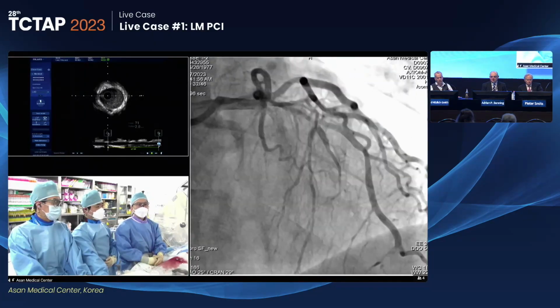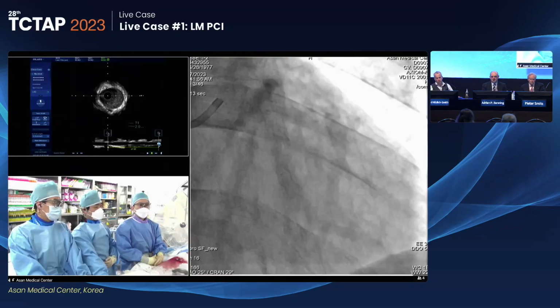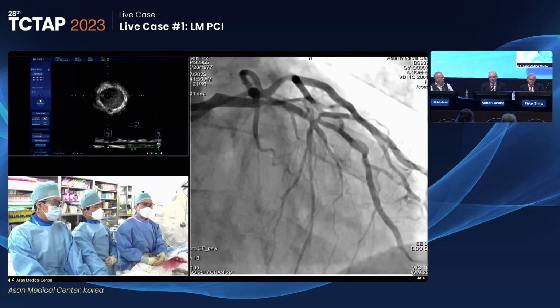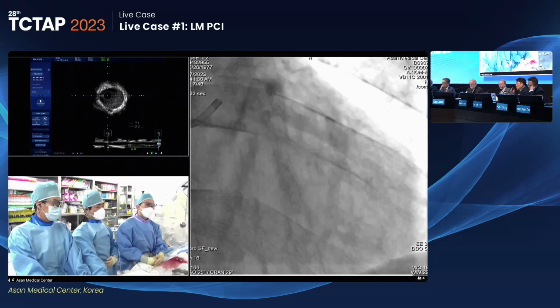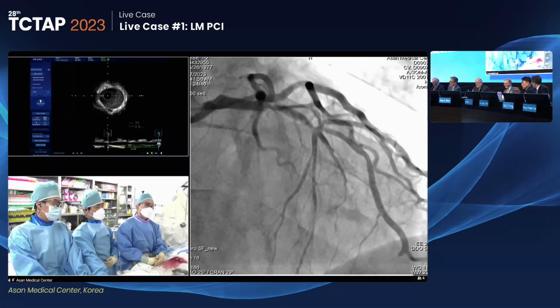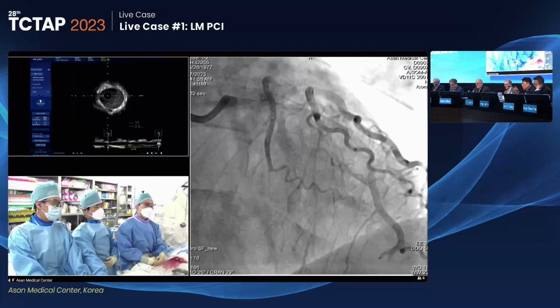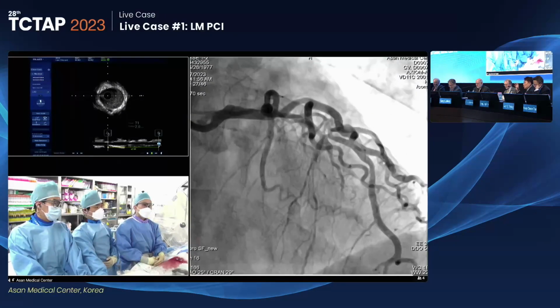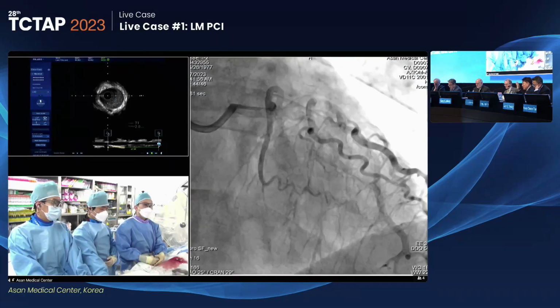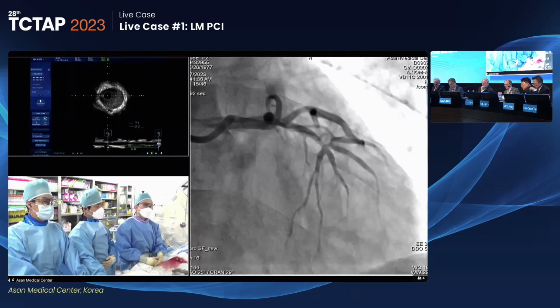And for me, this is still a provisional case. I think there's a good chance we could get away with one long stent in the LAD and a provisional approach in what is an important diagonal. All right, maximal opposition of a stent is important. However, I'd really like 5 millimeter squared in stent area. If the vessel diameter is more than 2.5, we can achieve at least 5 millimeter square. So we're going to make a good result and good clinical outcomes also. All right, Dr. Kang, go ahead.